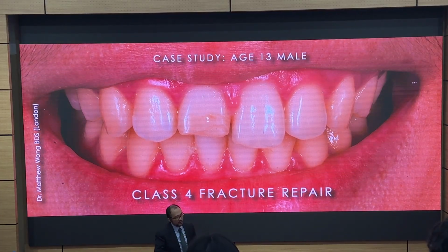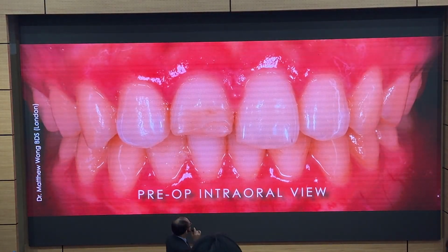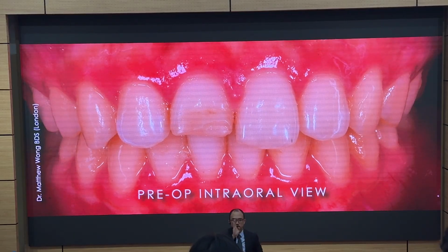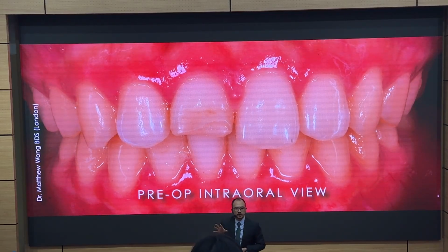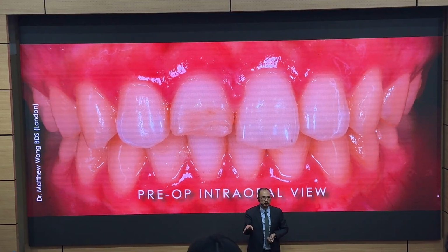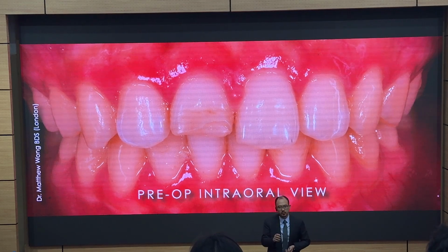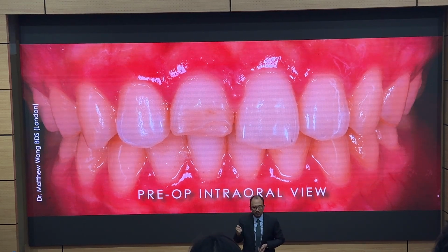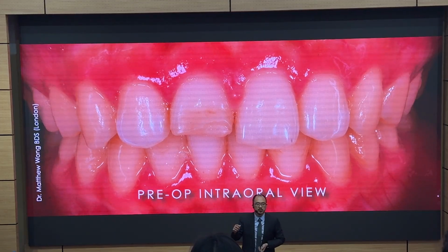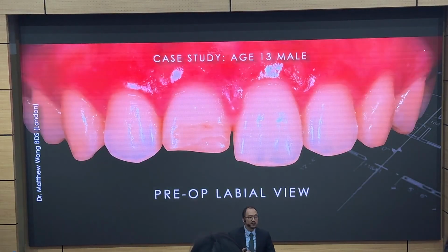Now, there's a technique that I want to share with you guys. When you're dealing with a young patient like this, a lot of times the tooth that you're trying to copy has more characteristics, translucencies, you have the mamelons that you want to copy. And sometimes it's quite hard to tell. Now, everyone in this room has a phone, has a camera, and everyone in this room should know how to edit photos now. So there's a trick that I was taught by my mentor, it's called the deep contrast view.